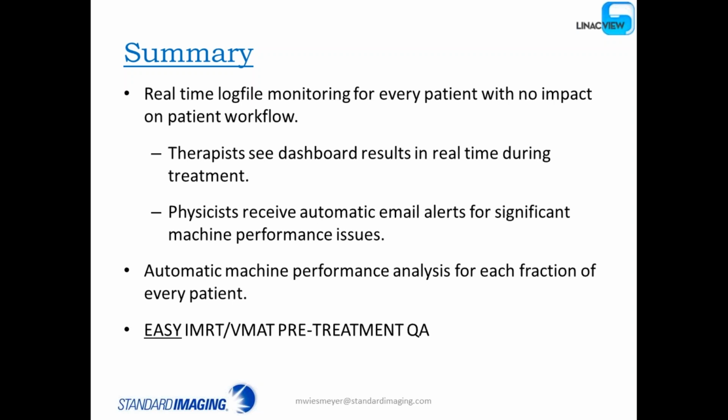And so I think this does not really impact workflow. It does add value, and as I had said before, essentially you're doing machine performance analysis for every fraction of every patient, and so it's easy to use, and I highly recommend you talking to your salesperson about purchasing it.